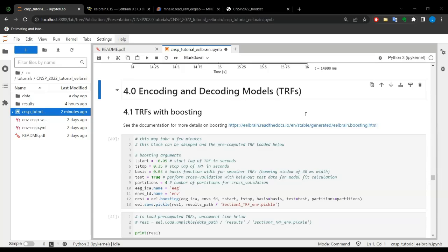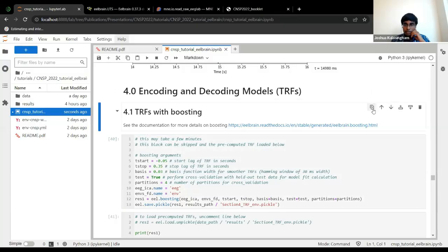Hi, Joshua. Yes. I actually wanted to clarify my question about the bad channels and the mismatching dimensions error. So far, whatever pre-processing you have been talking about is about one trial, right? No, it has several trials. Do you mean, oh okay, you mean each trial has a different number of sensors?